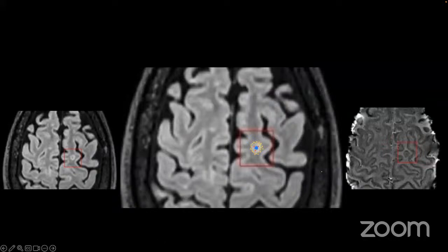I've seen some comments. Regarding whether a relapse might happen without a gad enhancing lesion: it can happen from a technical point of view, because there are possibilities that you don't get any enhancement because of the technique and because of the timing of the scan, but from a pathological point of view, there should be a leak to allow the lymphocytes to jump in.